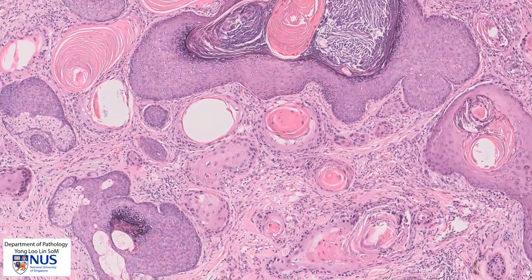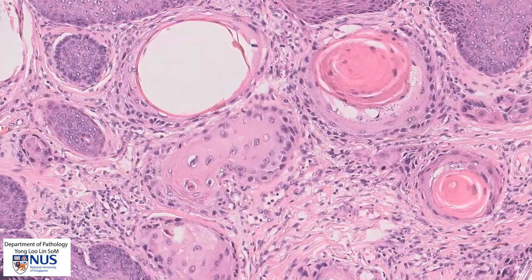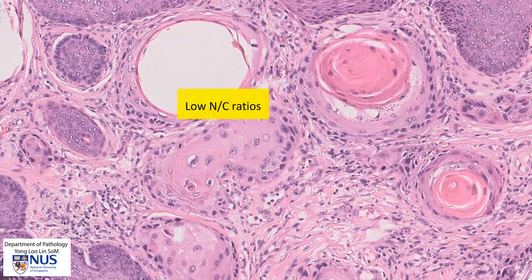Here we can see some irregular islands or nests of malignant squamous cells. The nuclei are quite irregular, they have prominent nucleoli, but they also have quite abundant cytoplasm. Hence, the NC ratios or nuclear cytoplasmic ratios are still quite low.